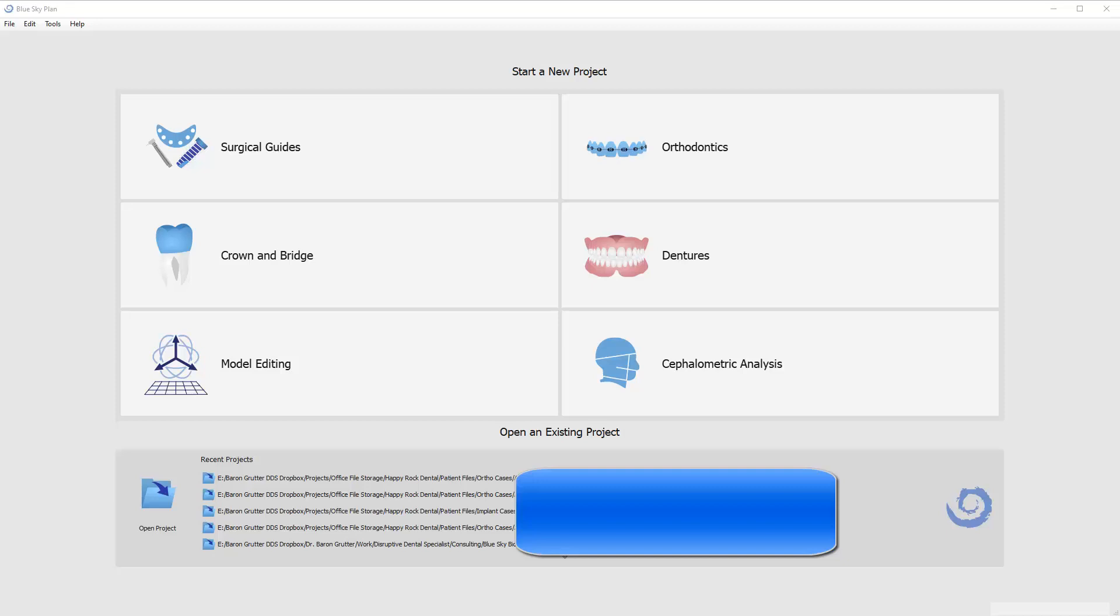In this video, I'm going to talk about how to use BlueSky Plan to plan a case for placement of an MSE appliance. That's a form of MARPE, which is Micro Implant Assisted Rapid Palatal Expansion. I'm going to walk you through what this looks like.